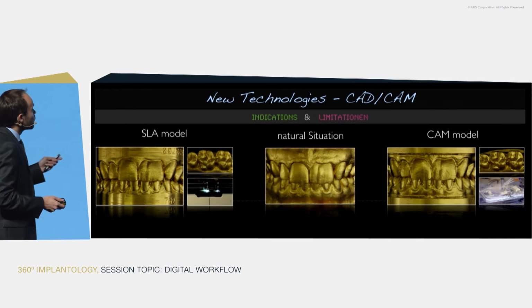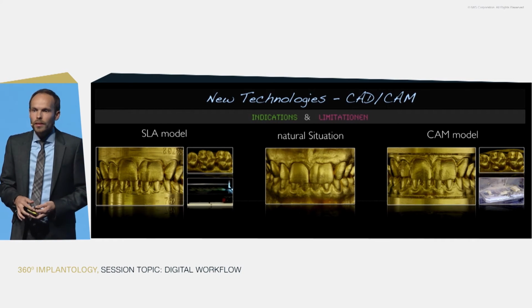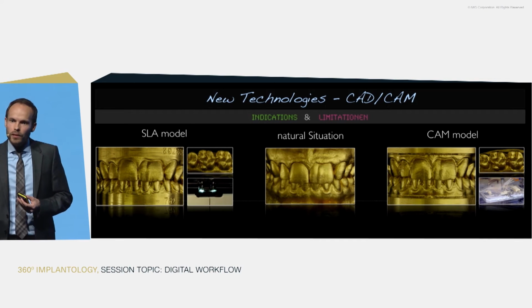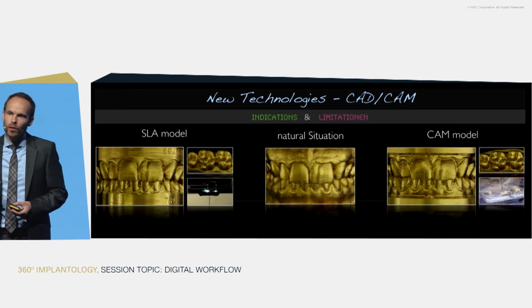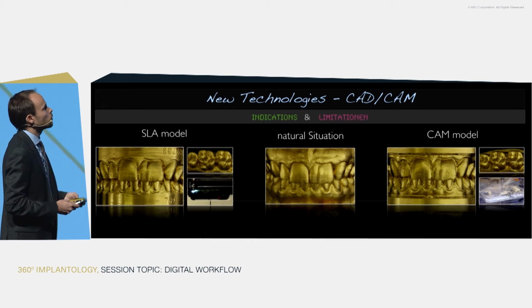Models, on the other hand, make life quite tricky at the moment, because we can create all of these models that you also saw during the past days, but combining them with the different implant analogs, combining them with minimally invasive approaches is not easy in all the steps. So here, I think we still need to work a little more.